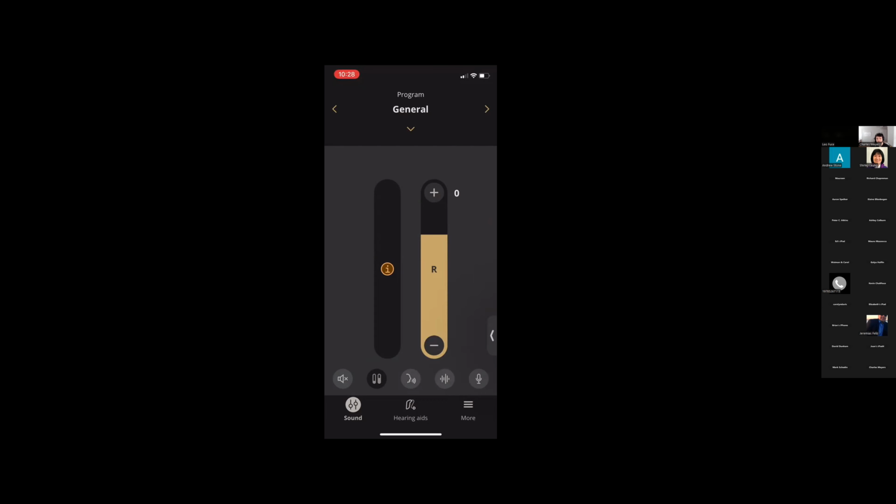So when your hearing aids raise certain levels of volume, which they do in parity to a certain extent so that certain sounds don't cancel out other sounds, they raise the entire volume level, not just the levels of your prescription or where you have a deficiency.